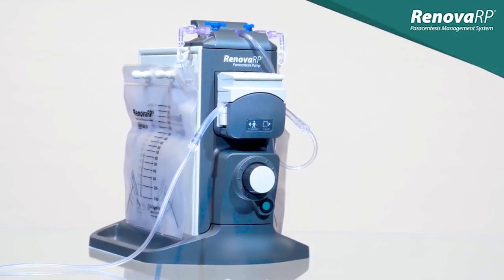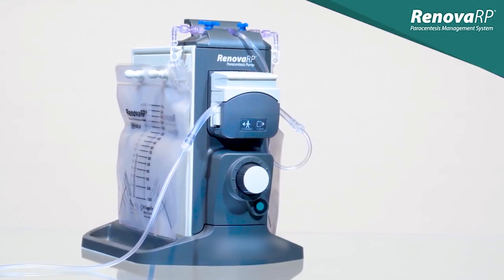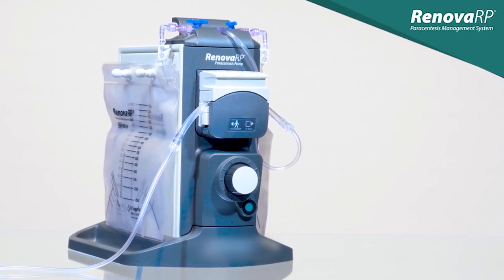The purpose of this video is to explain how the Renova RP Paracentesis Pump functions and how to properly set up and operate the system.